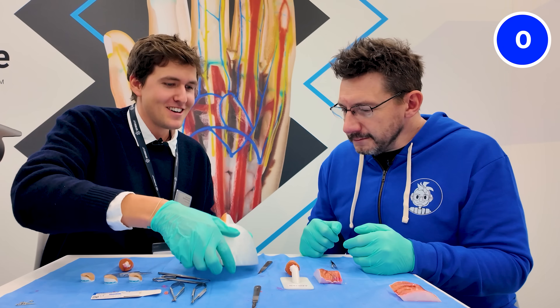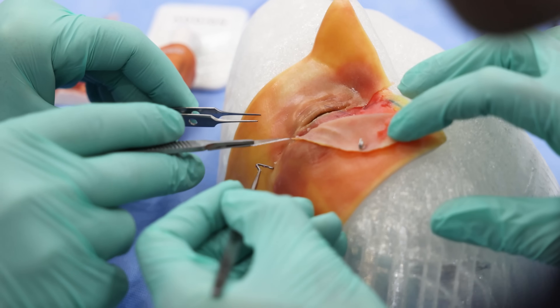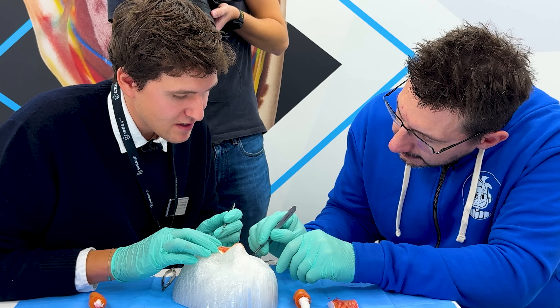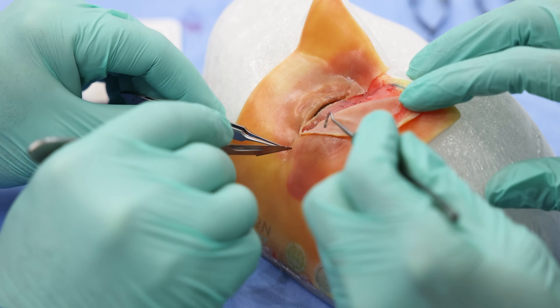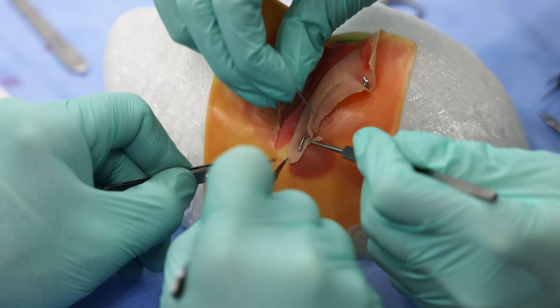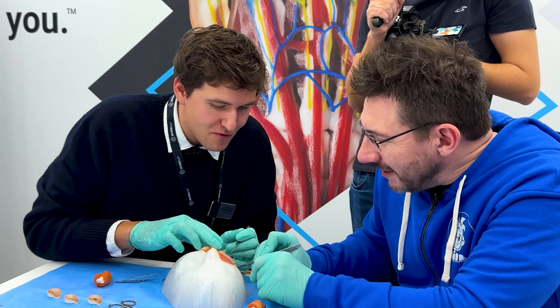The host tries a cut himself - locating the canthus area, which is at the corner of the eye. Starting there and going down at the right angle, you can feel a real drag force cutting through the material, like cutting through a rubber band, requiring correct knife positioning. So not only does this train someone for a specific surgery, but doctors can use it for general technique practice. Now getting into the fatty area where the nerves are - this is a critical part where you should not cut too deep in a facial area.